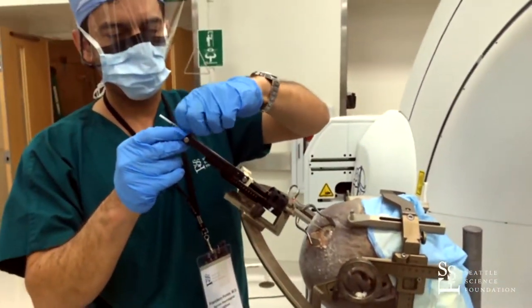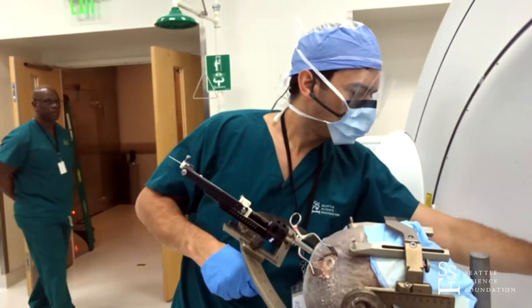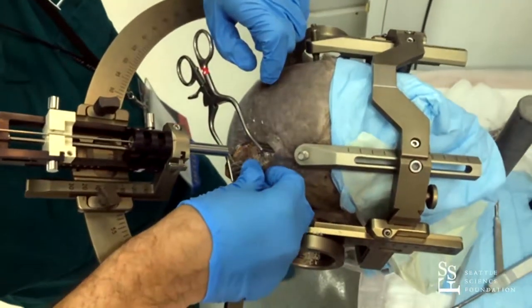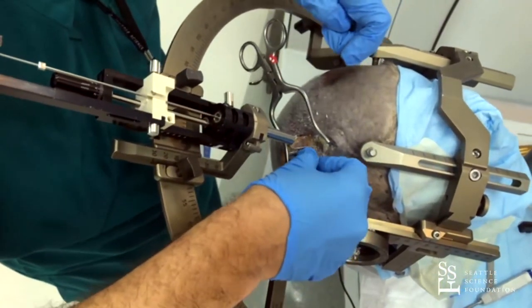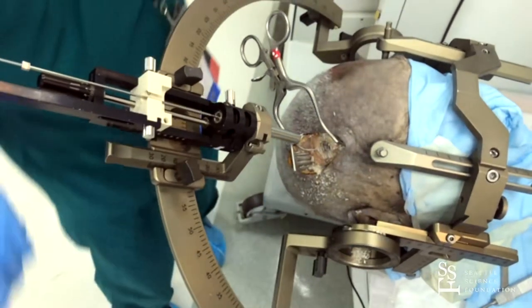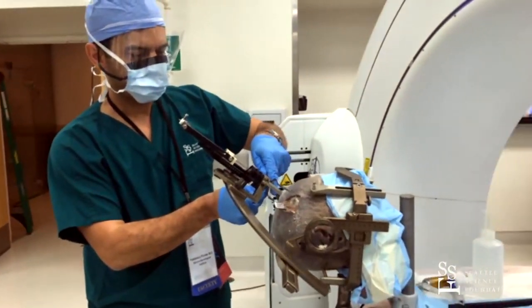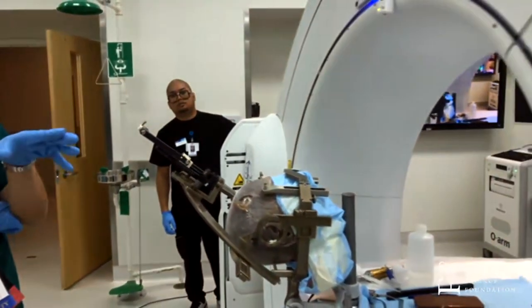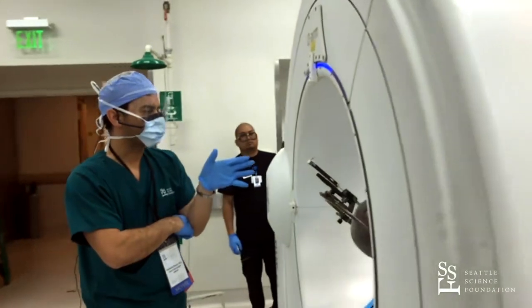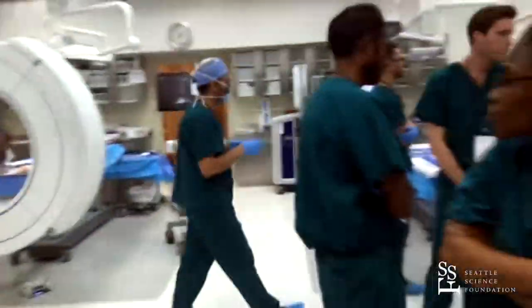Then I proceed with removing the stylet from the lead, and we'll place the cap — usually we'll have a little bayonet to help fold this down. There we go — now it's all locked in place, it's not going to move. Now we can get our confirmatory image with the O-arm, so we can bring the O-arm into place. For a unilateral case you can easily do this within 30 minutes; bilateral, about 50 minutes to an hour and a half depending upon teaching.